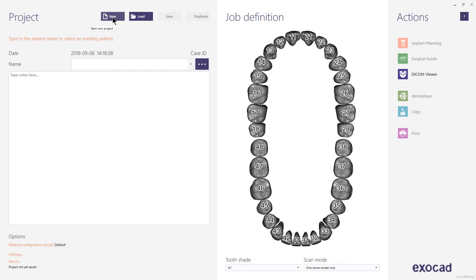In this short video tutorial, I will show you the Exoplan Implant Planning and Guide Creator Workflow. The software is intended to be used only by dental professionals with sufficient medical training in dental implantology and surgical dentistry. Do not use the software or DICOM Viewer for diagnostic purpose.